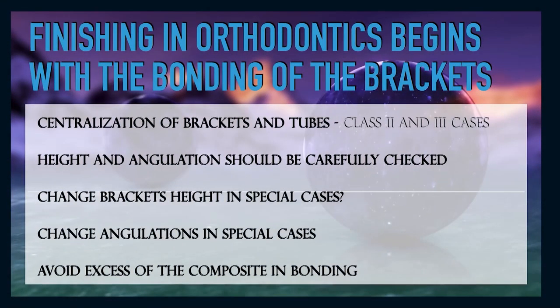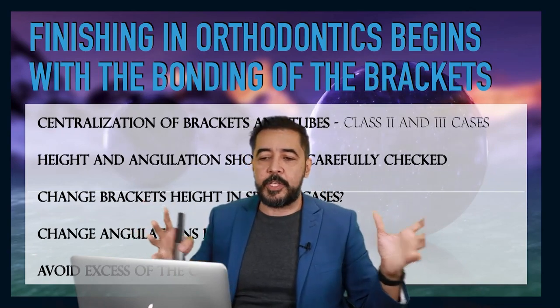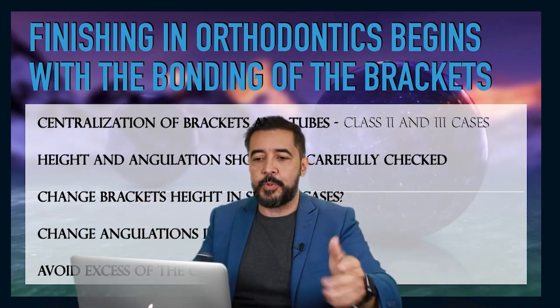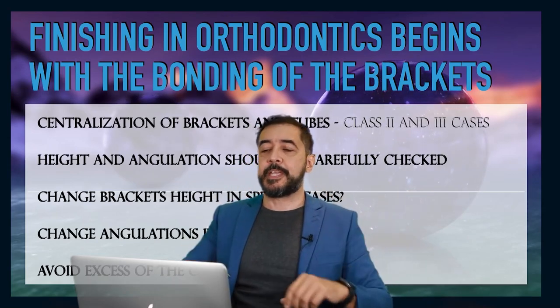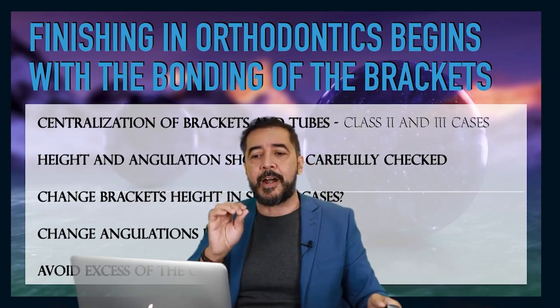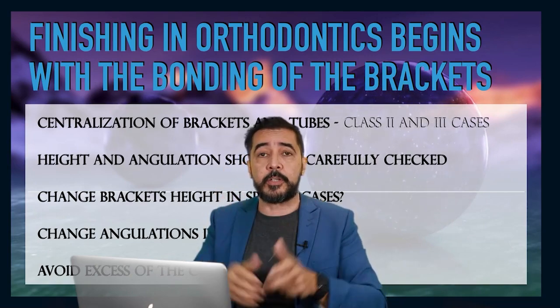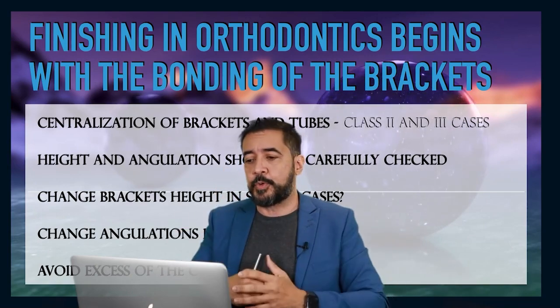So this is how we speak orthodontically. So this is how we create a unique vocabulary in order to communicate between me and you to do the correct movement and to understand what we are doing in our patients. So before doing this kind of movements, we have to understand that there are some topics that are very important in order to do a very correct, a very smooth treatment planning.